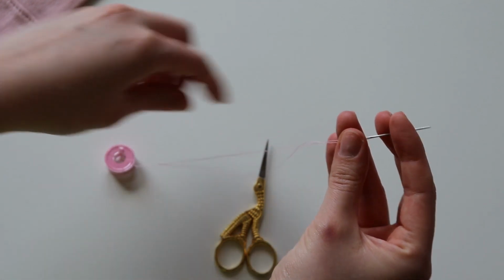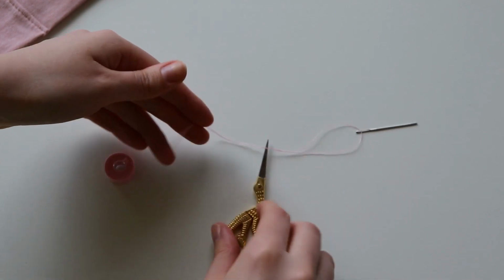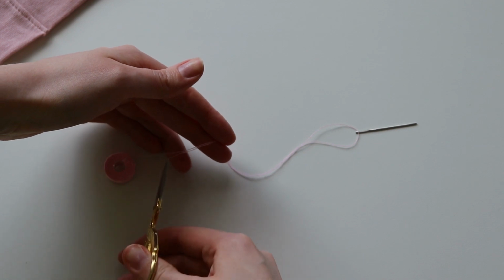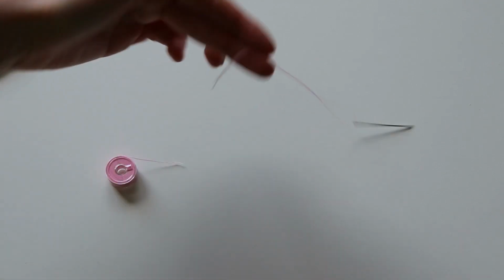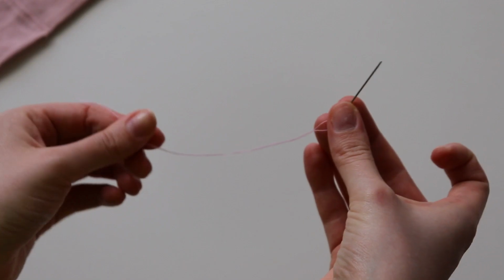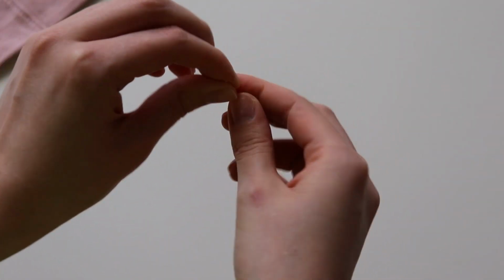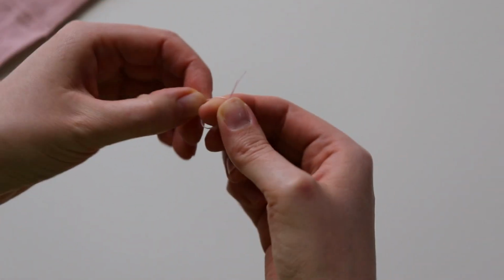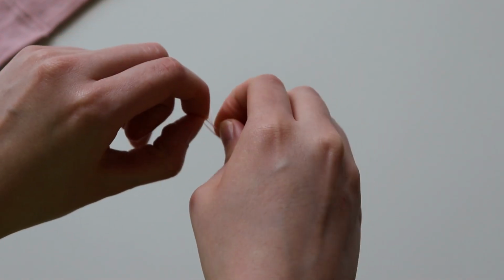You wanna give yourself, I'd say, about anywhere between 3 to 4 inches of thread on both sides. So again, this is a double piece of thread with about 3 to 4 inches. If you give yourself a little bit more, like I am right now, it does just make cutting everything a little bit easier at the end. But once you have this, you are now just going to want to tie the end two pieces together. So I am literally just doing a basic simple knot, taking this, pulling it under here.